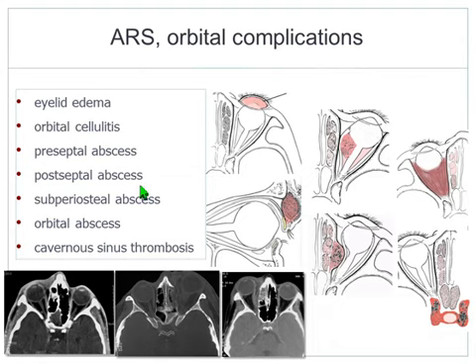Once the structure has been destroyed, the lesion can spread inside the orbit and produce an extraconal or an intraconal abscess. The more advanced condition is the one when you have the spread of the infection causing thrombosis of the cavernous sinus. Therefore, the cartoon is showing preseptal, is showing again preseptal, and it is also showing the passage from the ethmoid contained by the periosteal lining or the cellulitis, and the final condition that could be reached in some cases, which is the cavernous sinus spread.